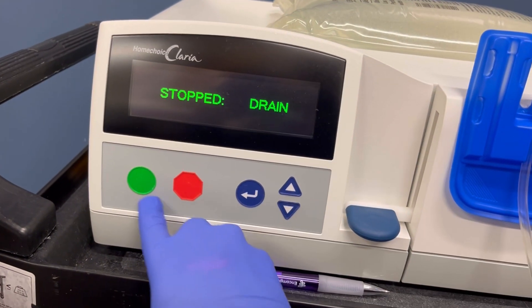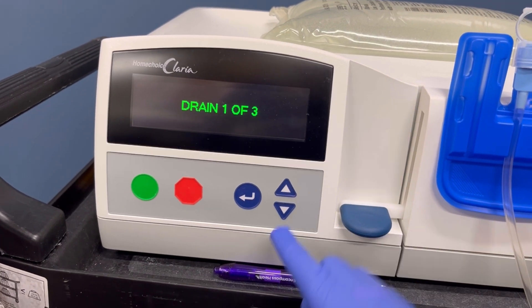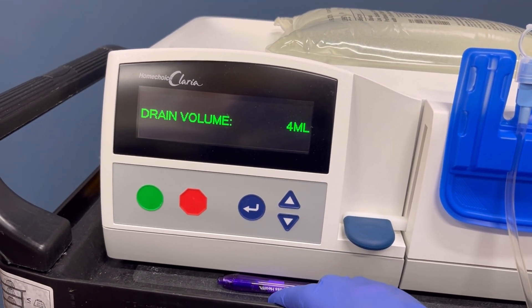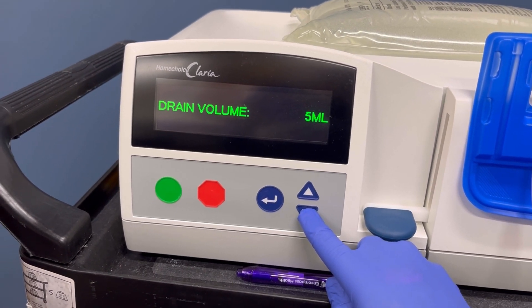Open my transfer set and I'm ready to go back in the game. Transfer set open, connected to patient line. Press green to go — it'll say 'please wait' and I'm back on drain one of three. I'm back at my four-milliliter drain, and now it's five. That's how you do an emergency get-off on the machine in case an emergency happens and you have to disconnect from the machine during treatment.